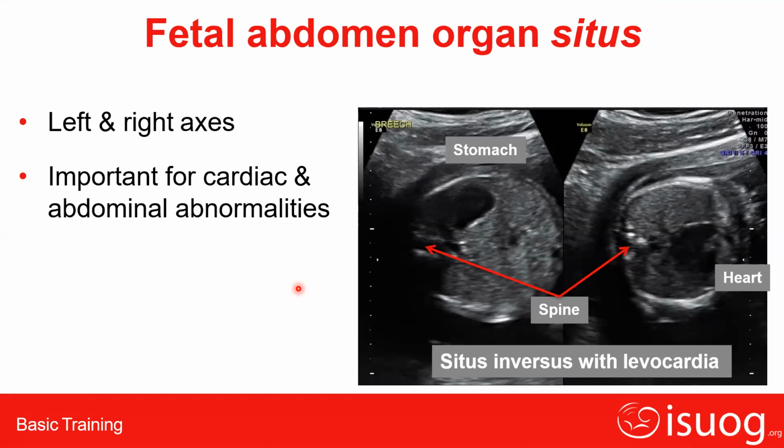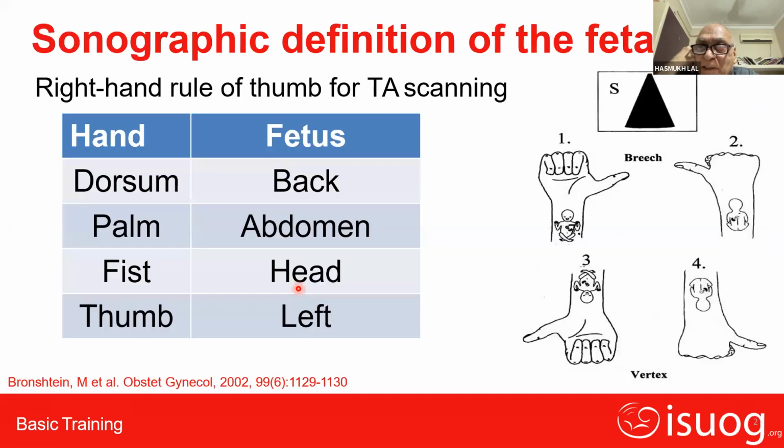So I believe there is a pictorial representation also. There are some slides you can show. This one you can see now, in this diagram the head is towards the fist. So it needs a little bit of practice to understand, sir, actually.